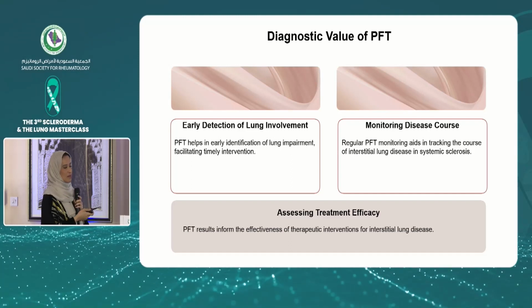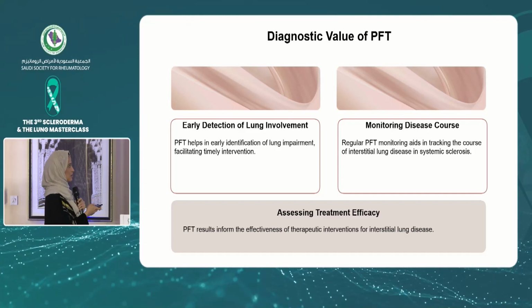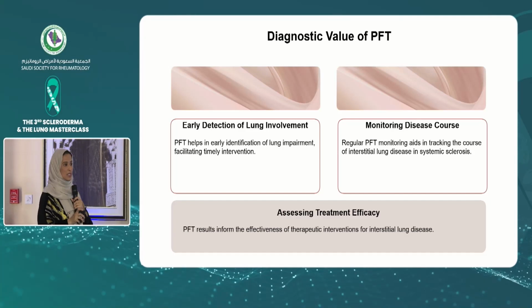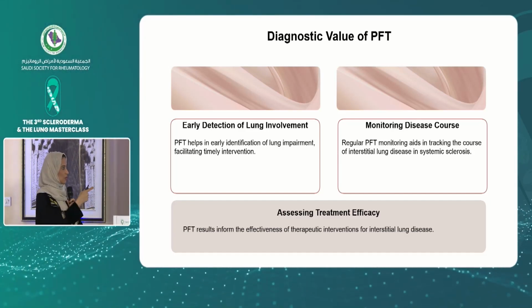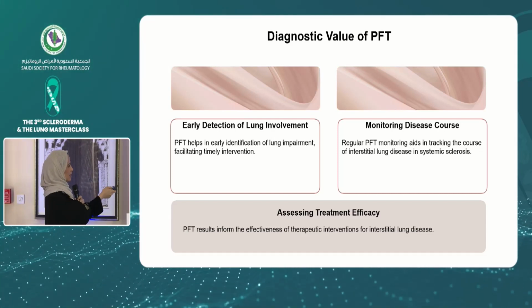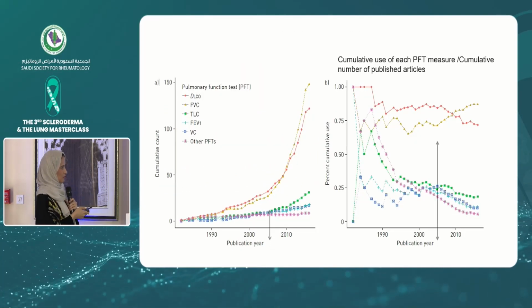So what's the diagnostic value? What are we actually doing PFTs for? It's either that we want to detect the lung involvement early during the disease course, or after the disease has already been established, we want to monitor the disease course, or we want to assess the treatment efficacy. I'm going to go over every box of these next time. So, starting with the early detection of lung involvement.